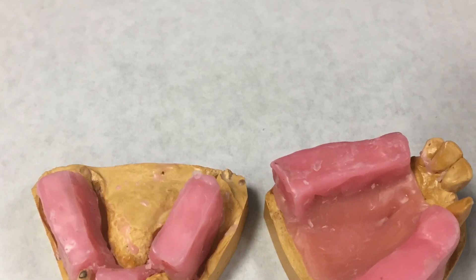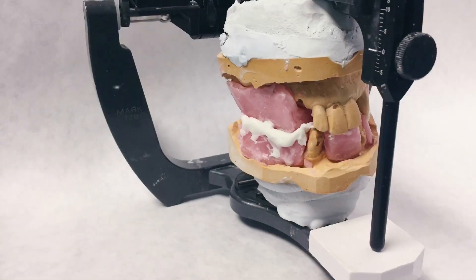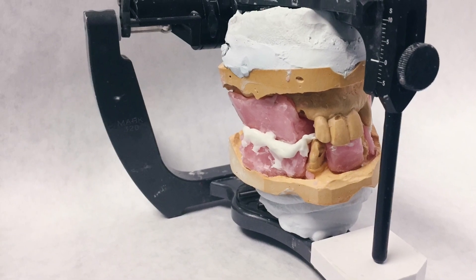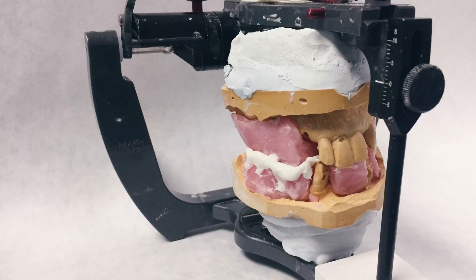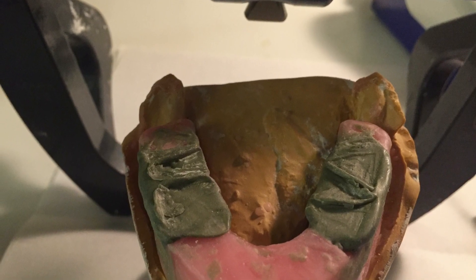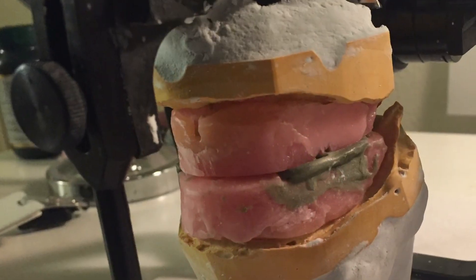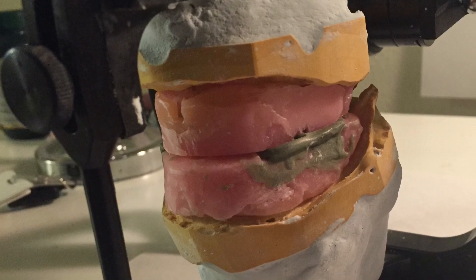Once the wax rims are completed and level, you go ahead and put them in the patient's mouth. Then you adjust them to make sure they're level and on the same plane. In this example I used Vanillabite, and in this example I used Aluwax. I personally like Aluwax — the green one — because it doesn't fall off as easily as Vanillabite does, but again that's personal preference.